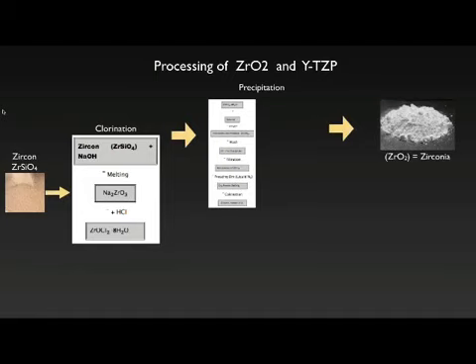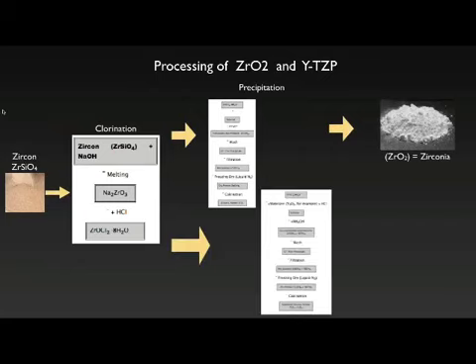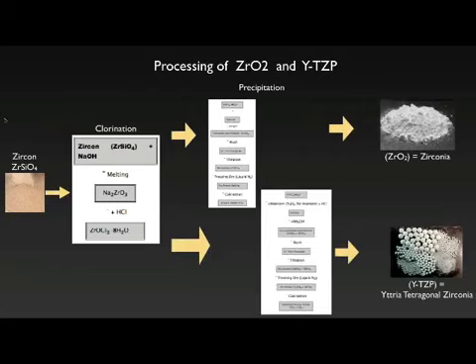Now, this ceramic is fragile, as you saw, as are a lot of the ceramics. And zirconia on its own is as well. There's a process where yttria stabilizes this structure. And this is the beauty of what yttria stabilized zirconia is and how it's used for all these high-stress applications. Now, again, I stress the fact that I'm not a chemist, but there's a complicated process that takes the zircon sand through chlorination and precipitation steps and creates this yttria stabilized tetragonal zirconia.